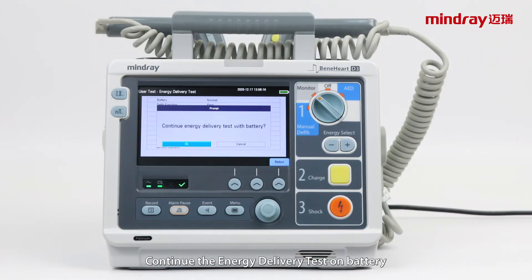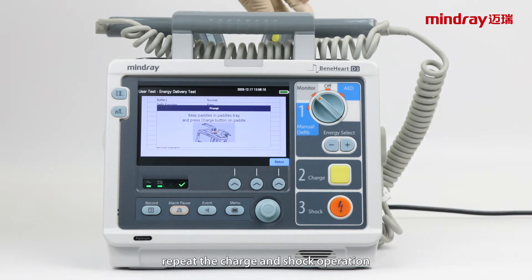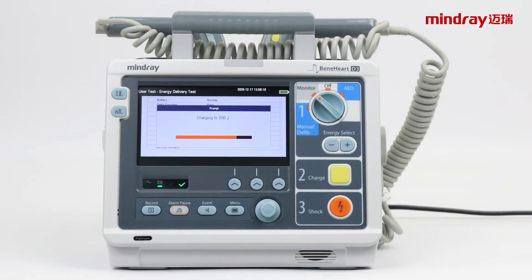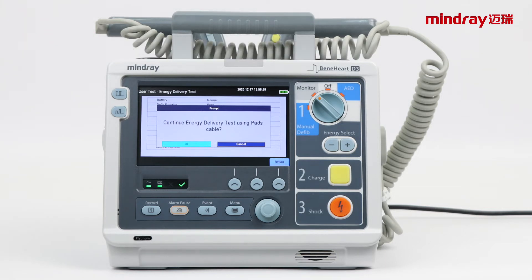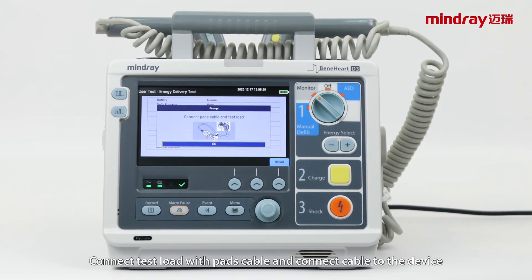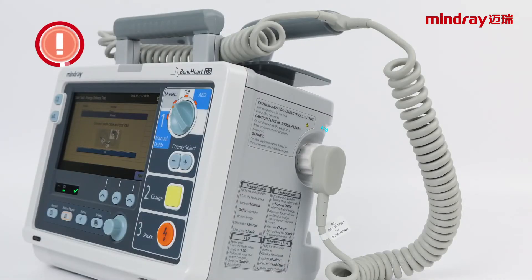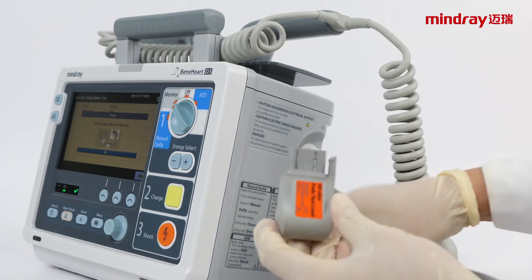Press both shock buttons together on the paddles. Continue the energy delivery test on battery. Repeat the charge and shock operation. If you have a pads cable, continue the pads cable test.